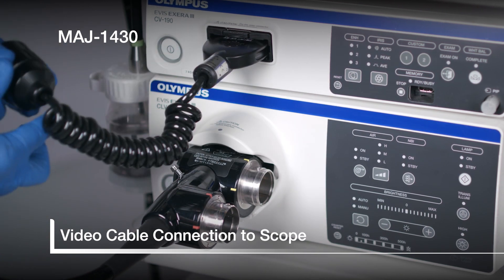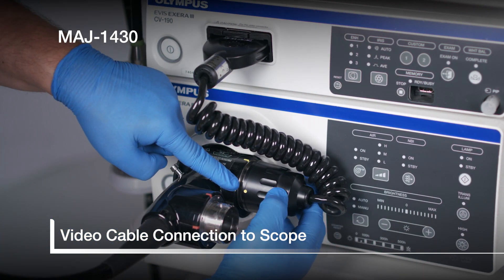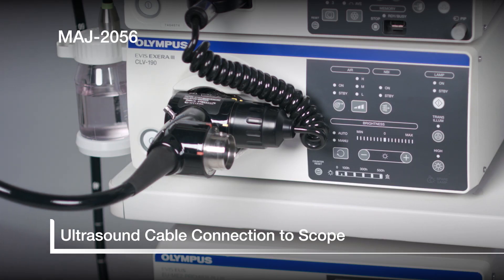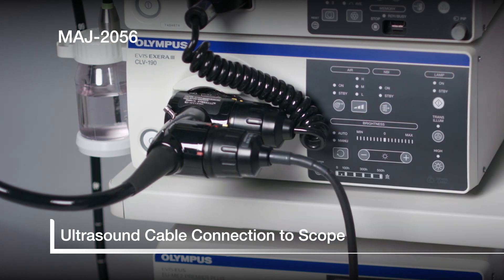Now connect the video cable by lining up the yellow markers and rotating clockwise to the top yellow mark. Next, connect the detachable ultrasound cable in the same manner using the red marks.